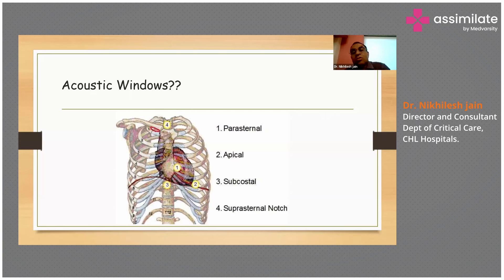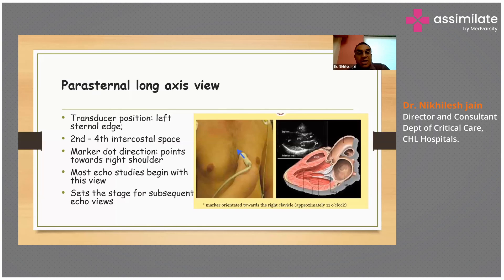We start off with the parasternal long axis view, which rests on the left sternal edge. Most of the times the image is acquired from the second to fourth intercostal space. The marker direction points towards the right shoulder. Most echo studies will begin with this view and it sets the stage for subsequent echo acquisitions. If you look at the image, you can see the mitral valve opening into the left ventricle and the left ventricular outflow tract going into the aortic valve. Higher than that is the septum and the right ventricular outflow. This is how a typical parasternal long axis view looks.